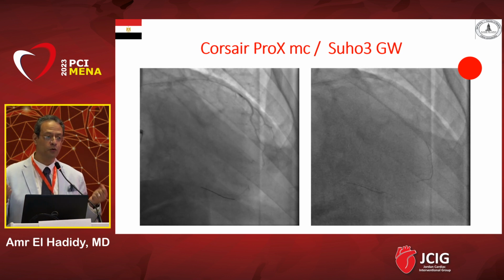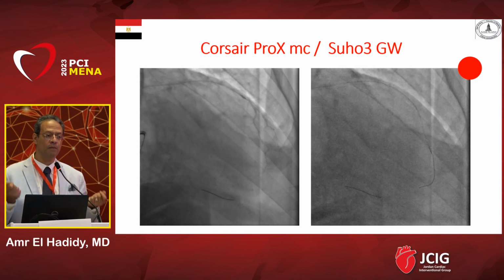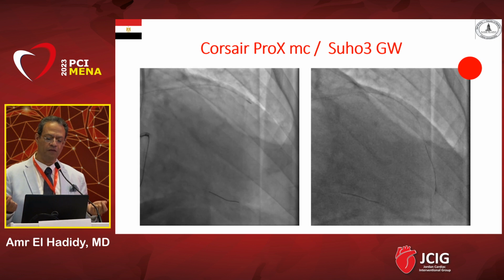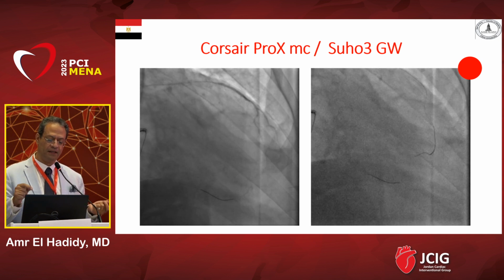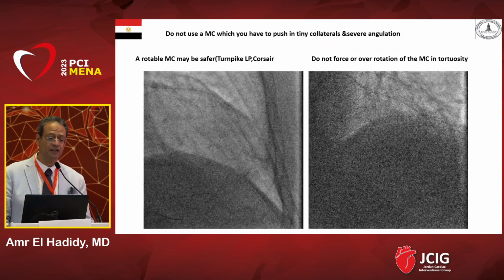Wait and don't push, because it's very fragile, and you need to follow with the microcatheter. Very important, because it's a very weak wire. So if you look here, we'll be waiting for the heartbeats, and then it goes to the distal RCA and the side branch.